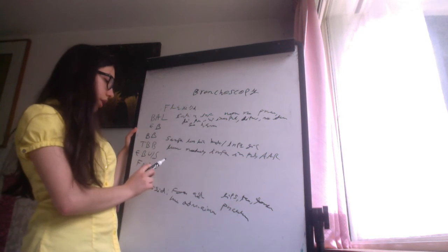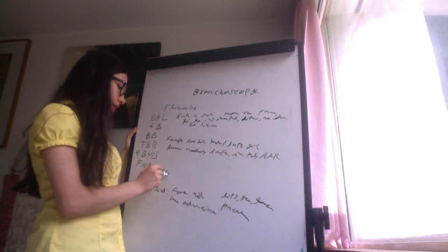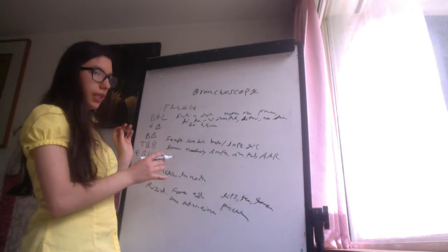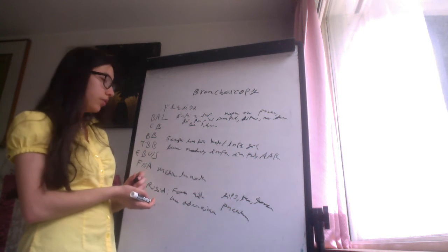The fine needle aspiration is to assess the mediastinal lymph nodes to see if there is malignancy or metastasis to the lymph nodes.